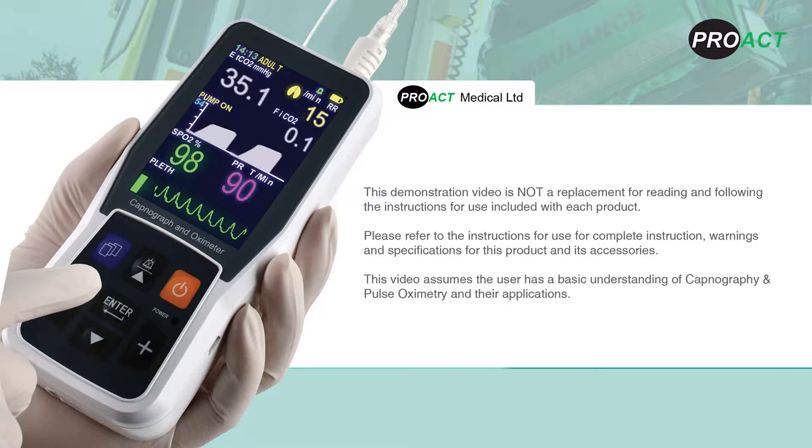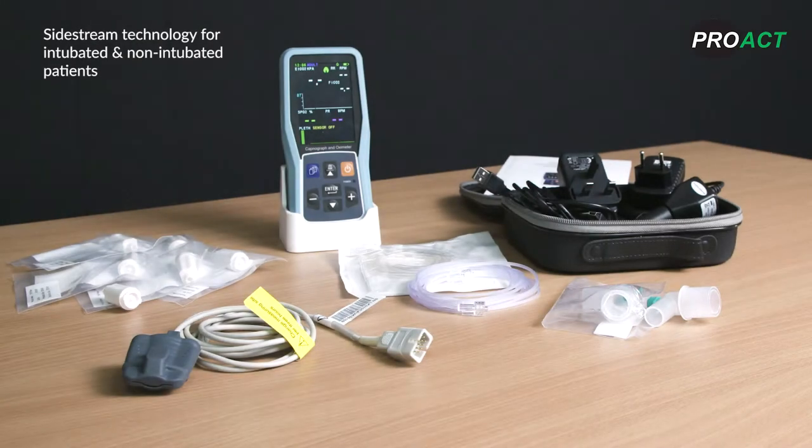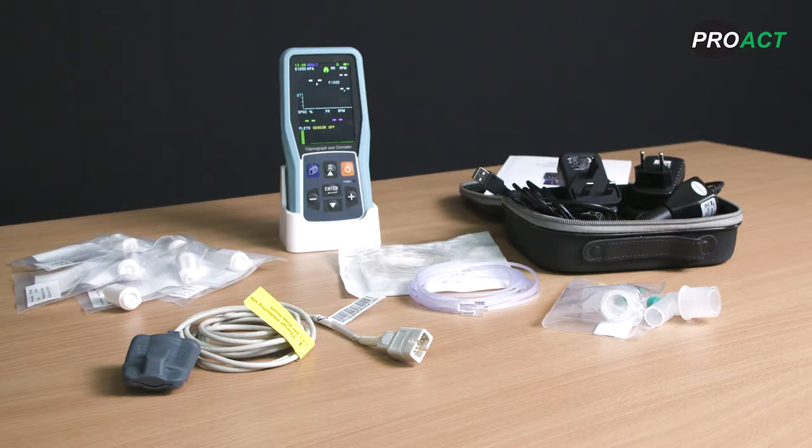This video assumes the user has a basic understanding of capnography and pulse oximetry and their applications. The Creative PC900B is a handheld latest generation capnograph with pulse oximetry for adults and paediatrics. Capnography is of a sidestream type and can be used for intubated and non-intubated patients. The capnography technology is low volume, non-dispersive infrared absorption and the SpO2 technology is Creative's own bespoke technology.